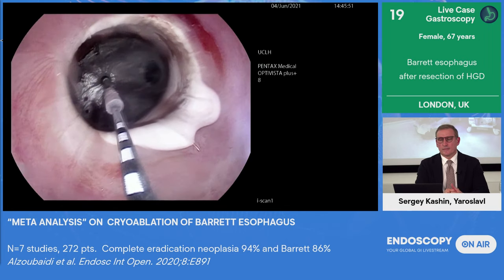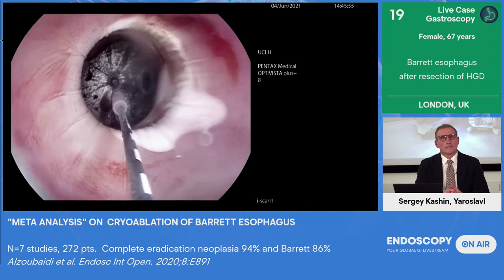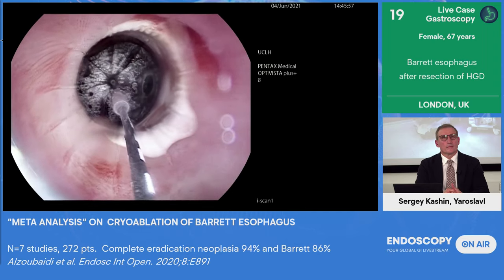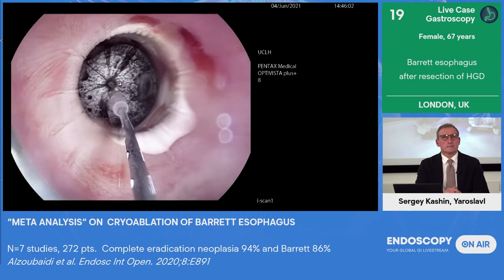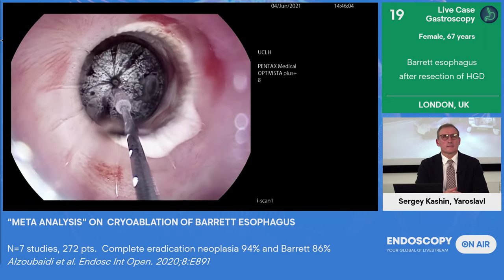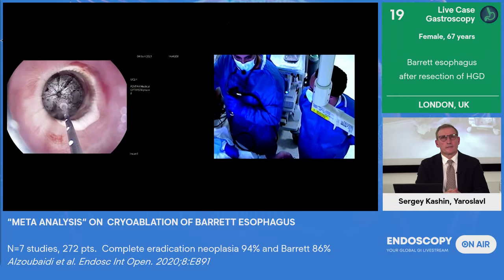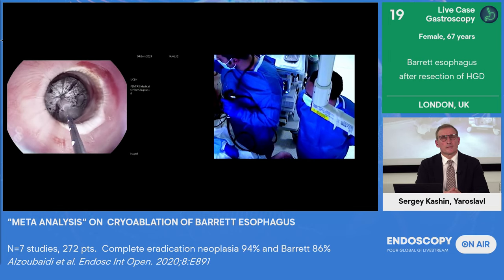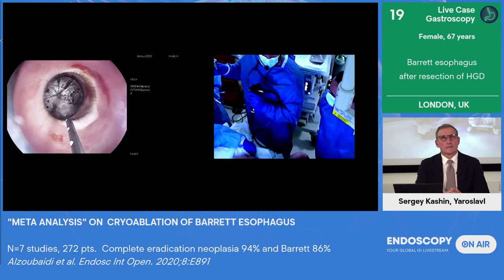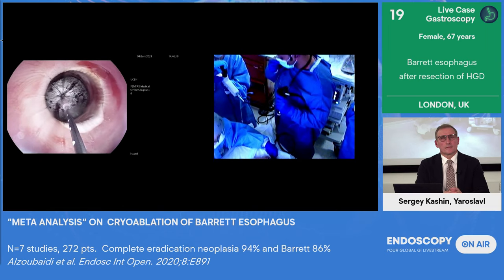So what you can't see is what's happening in the background. The team have just changed the cartridge. So I've done 7 ablations with 1 nitrous oxide canister. Can I have a look at that canister, guys? So that's what it looks like. Some of you that go to recreational music festivals may be familiar with this device, I'm told, but I wouldn't know this. So you normally get about 6 or 7 sprays with one of these canisters. The team are just going to change the canister.